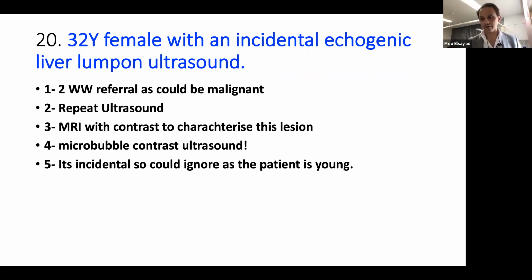So we can have another lecture if you all like, about microbubble contrast ultrasound, just to inform you more about it and how it can help you in identifying these things. And the experience is quite better because they have a chat with the radiologist who's doing it. They can know what it is exactly at the same time, and it eases the pressure and the fear. You can request it as a GP, of course. This is what I'm saying is the best test. It is safe, it doesn't cause nephrotoxicity or liver toxicity. You don't need any test before. You just send it to us, we will do all the rest.